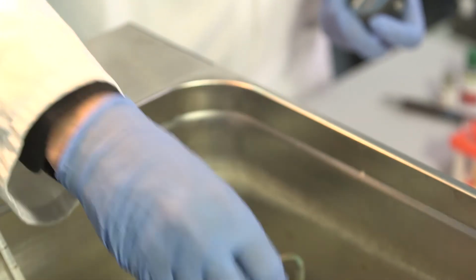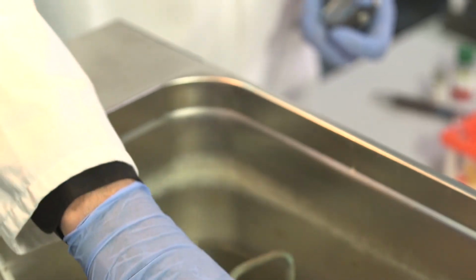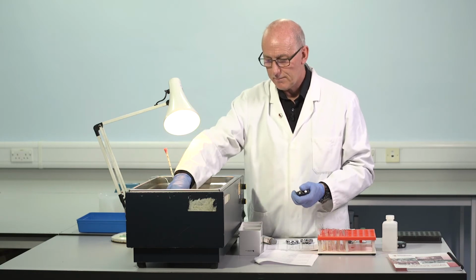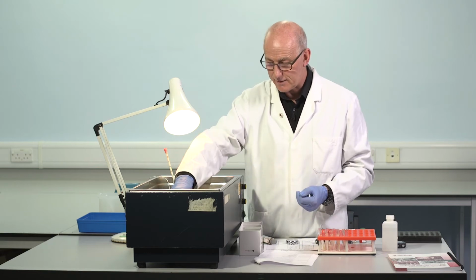Probably the most important pre-analytical variable in relation to factor VIII would be storage of the sample if it's deep frozen. And I already mentioned we absolutely should avoid storage at -20, particularly in domestic grade -20s.